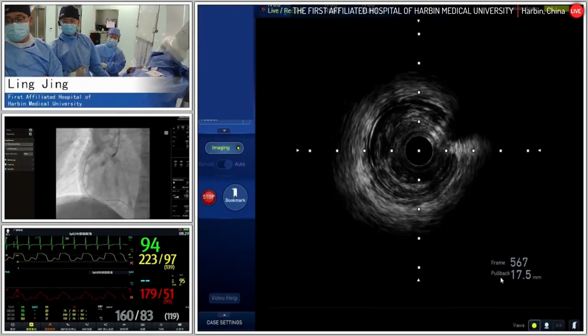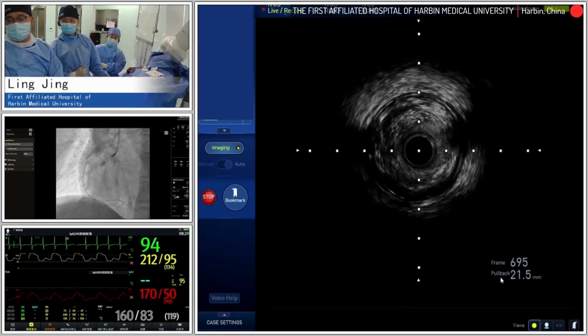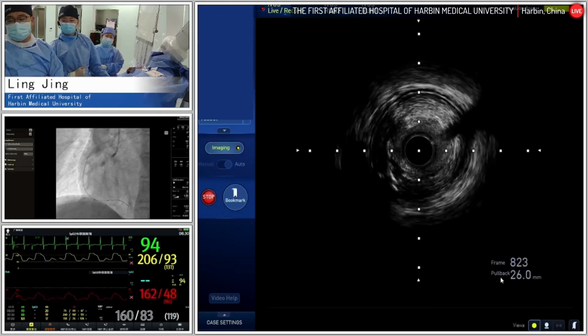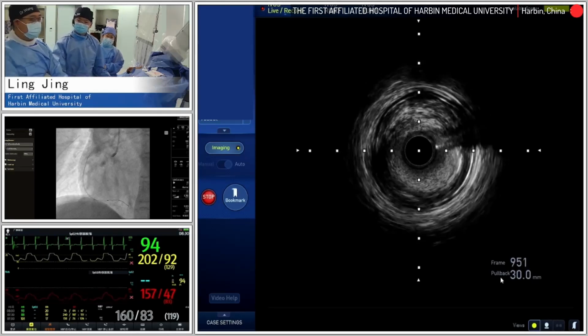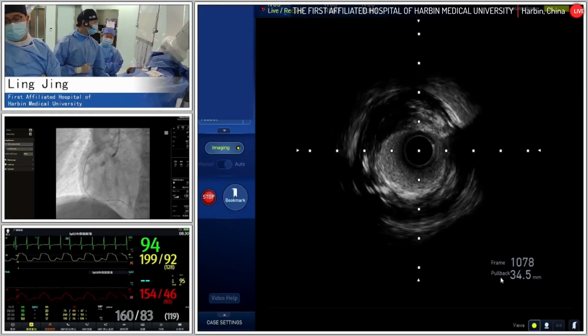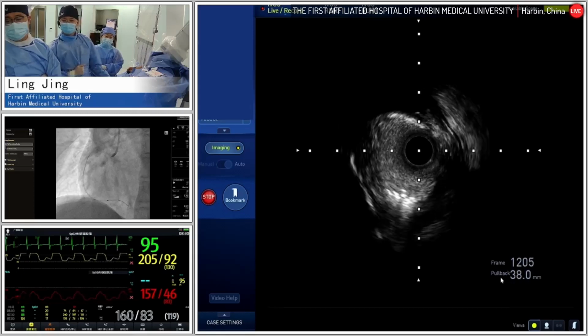Still we can see a lot of plaque burden at the distal landing zone, if it is a potential choice, only seems to be a 2.5 millimeter, but the plaque burden is an issue. And we notice that after modification, if the residual plaque burden is still over 60, it's a potential high risk for stent underexpansion.